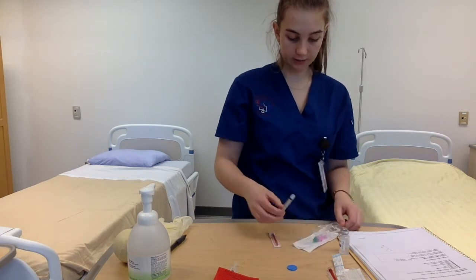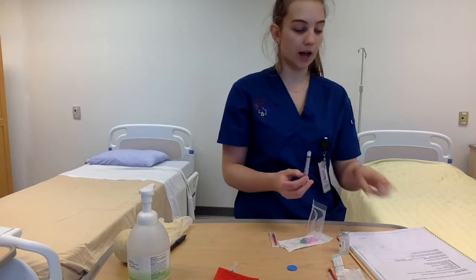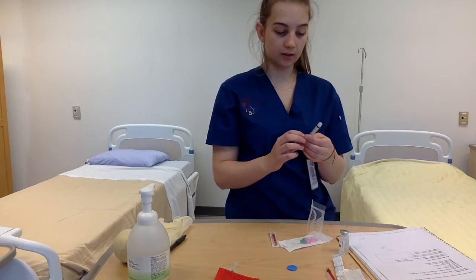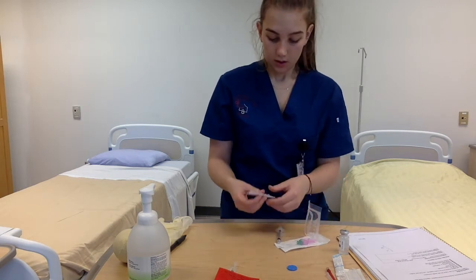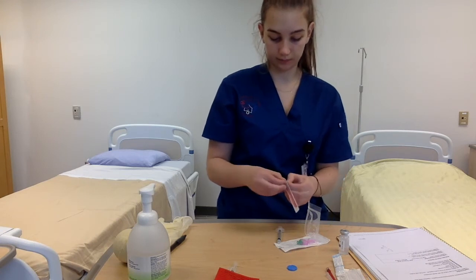Very carefully. And for this medication, the correct dose, as on the MAR, is 0.5 milliliters. So I'm going to be choosing this syringe that is in milliliters, which is very important. And I'm first going to be attaching the blunt tip needle.